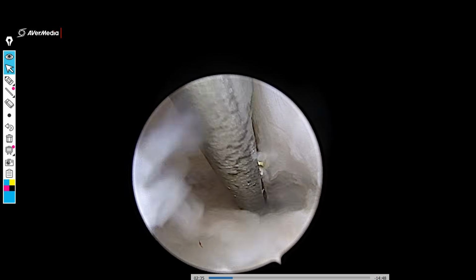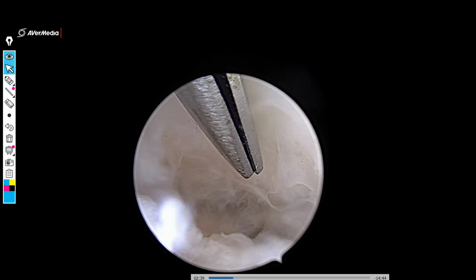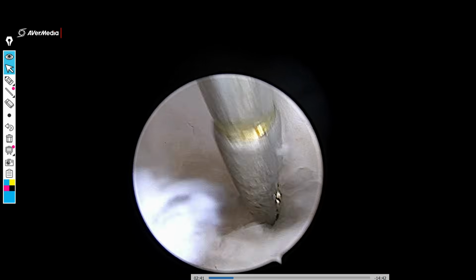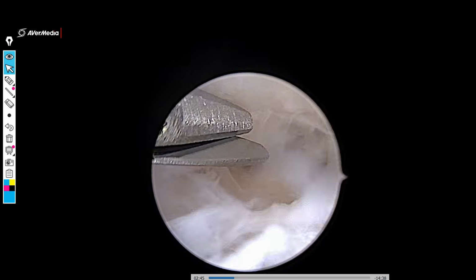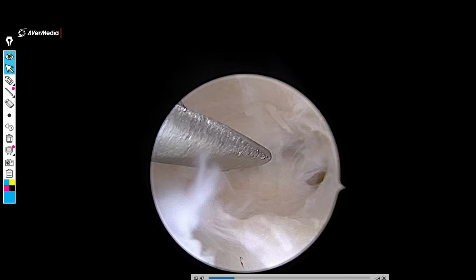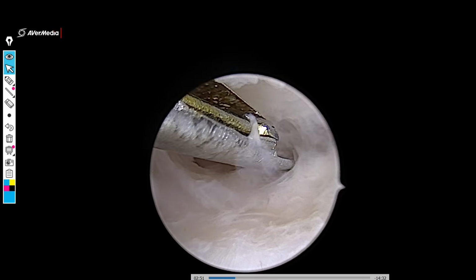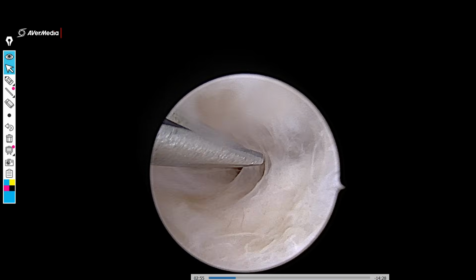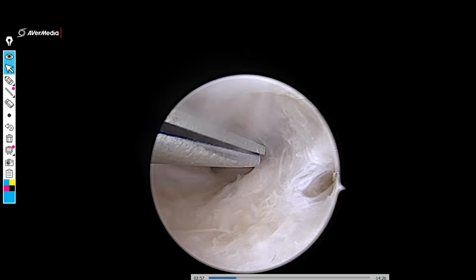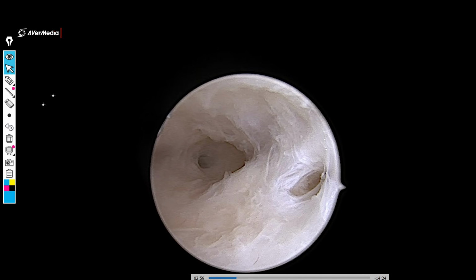My choice of doing this surgery always has been the hysteroscopic scissors as compared to a resectoscope, because it causes minimal trauma, or actually zero trauma, to the surrounding endometrium. So you can see, by gentle movements of the scissor, just snip out those areas which appear to be a little rarefied and less fibrosed compared to the remaining tissue. And here you can probably see we have been able to show one ostium.